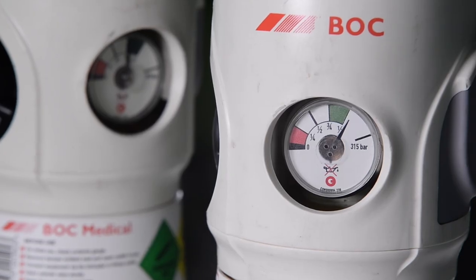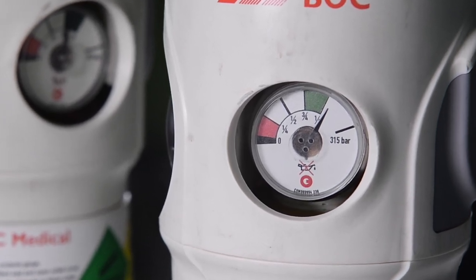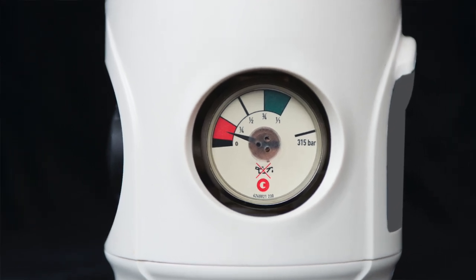Ensure you have sufficient gas for the treatment by inspecting the contents gauge. If the needle is in the red zone, there is a limited capacity and you may need to change the cylinder.